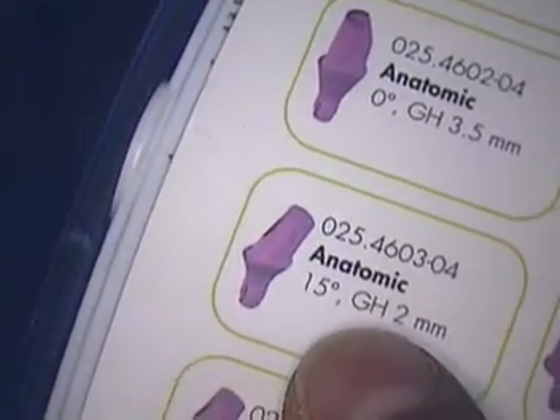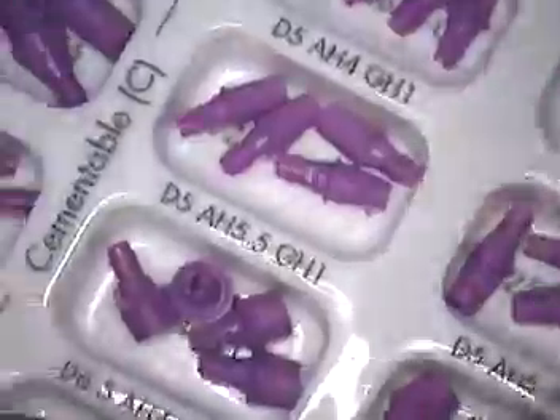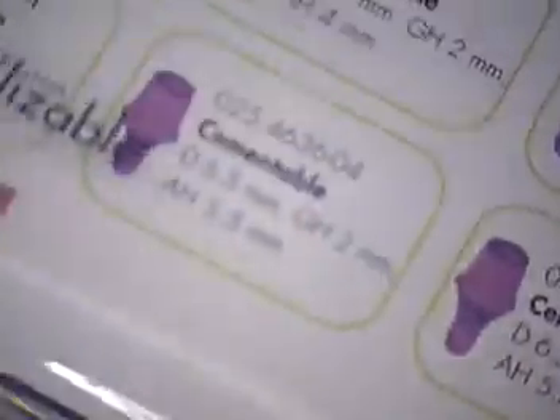So that's the 15-degree GH2 — that's the gingival height, two millimeters. If you order this box, you will get a number of various sizes and shapes to help you with your dentistry.